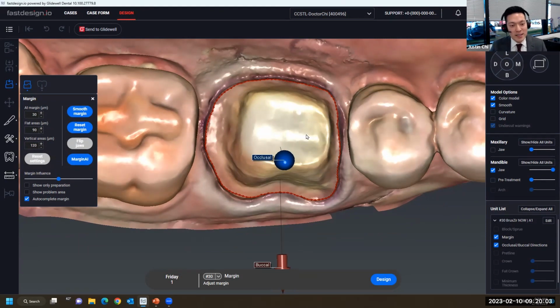I often hear from many new offices that adopt digital dentistry and in-office CAD/CAM, and it's mostly from the assistants, that their doctors are so resistant to packing cord. But I understand it's not the easiest and most enjoyable procedure to do, but once you see the fact that we have to find the margin, even if you are submitting it to the lab, someone is trying to find the starting point of that restoration.